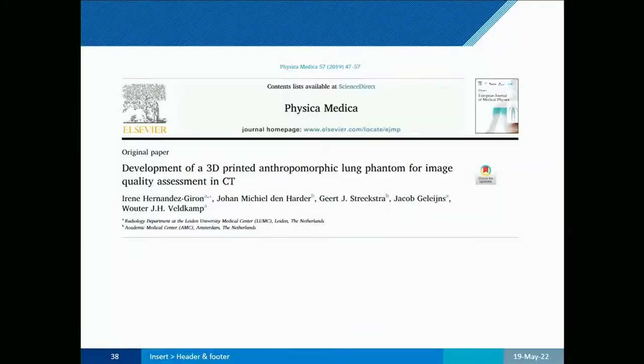For this, we will go for imaging. We inserted the lung phantom into a thorax-shaped holder. This will come in handy later because, of course, we want to try to mimic conditions similar to what we would have when we put a patient in the scanner. And if you want more details, you can have a look at the paper where we talk about the equations and all that kind of stuff for the production of the phantom.